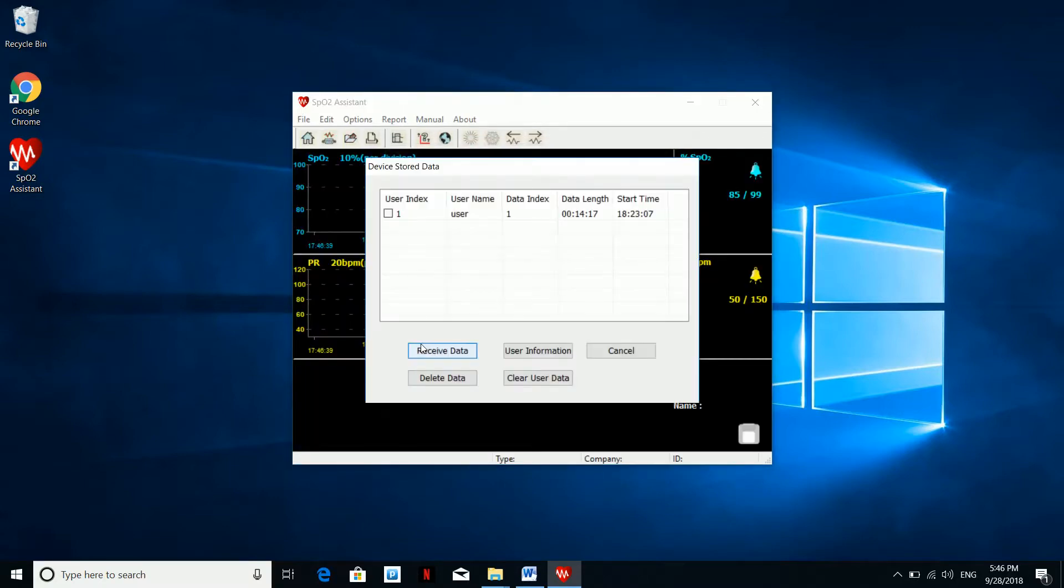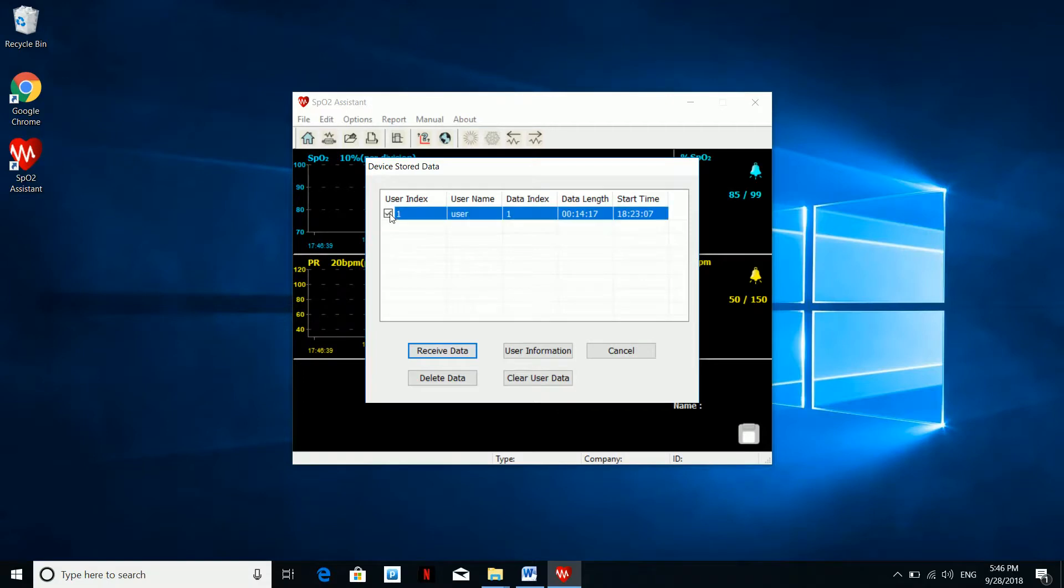The next window will automatically pop up showing the user name in the table. Make sure you select the user name by ticking the box. You can also see the recorded data, duration, and time it was recorded.